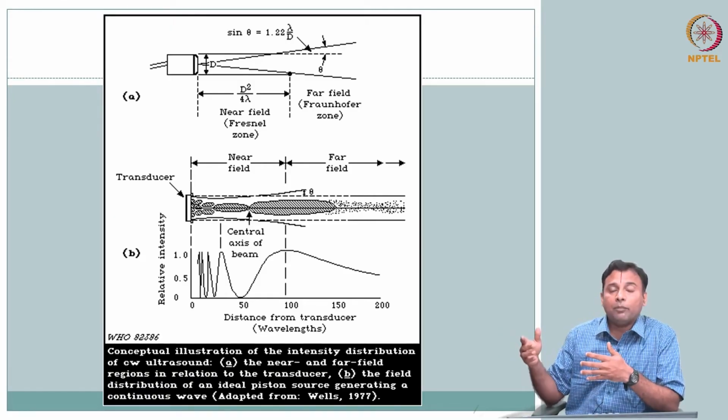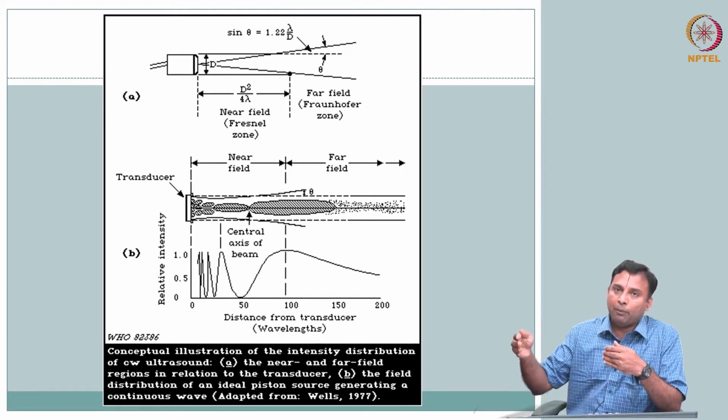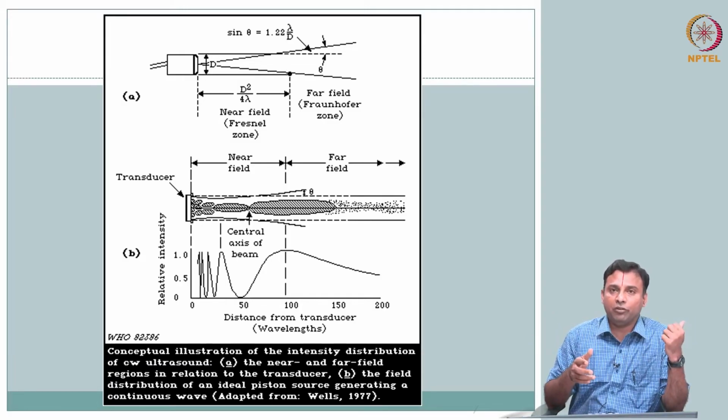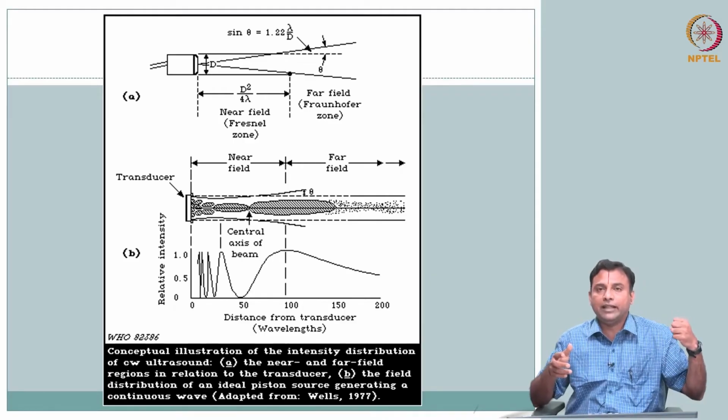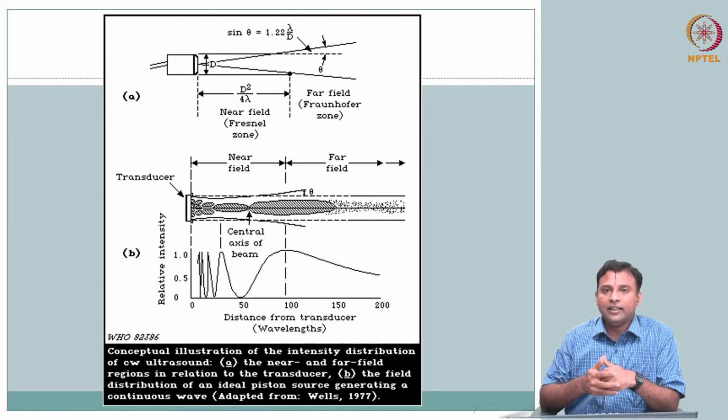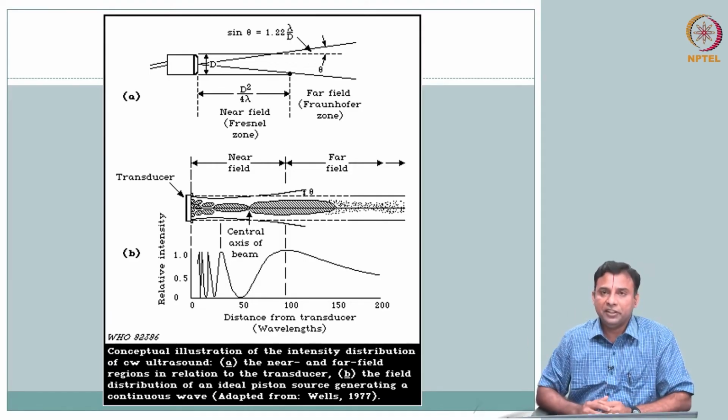We saw all the properties about the reflectivity, as impedance mismatch. So, a portion of the signal, or the echo of the signal that you sent, comes back, and the same transducer, the piezoelectric crystal, now when it is hit with a pressure wave, gives you a voltage waveform. That voltage waveform is taken and processed further, and you get the image display, signal processing, put together, organized in an image and displayed.